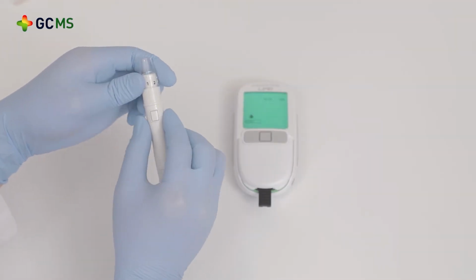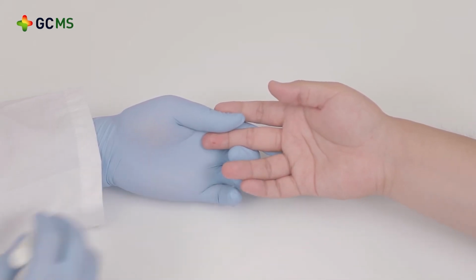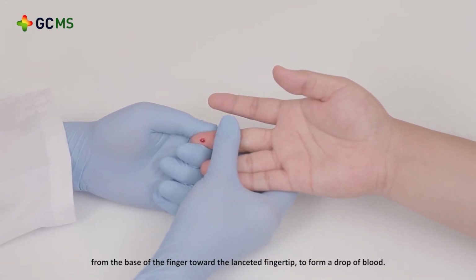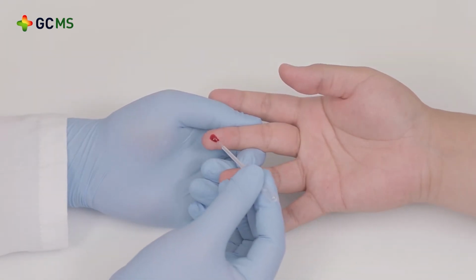Then prick the fingertip using a lancet. Firmly press the lancet against the puncture site to activate the device and puncture the skin. Apply gentle pressure. Massage the lanceted finger vertically from the base of the finger toward the lanceted fingertip to form a drop of blood. Use the capillary to collect a drop of blood.